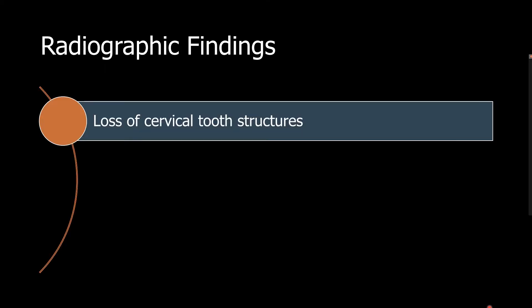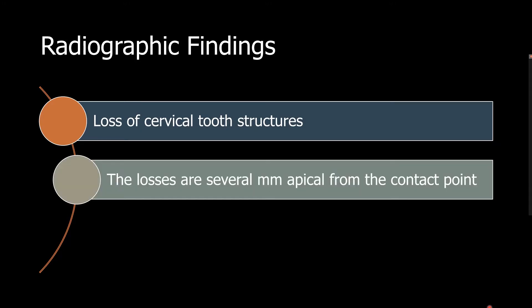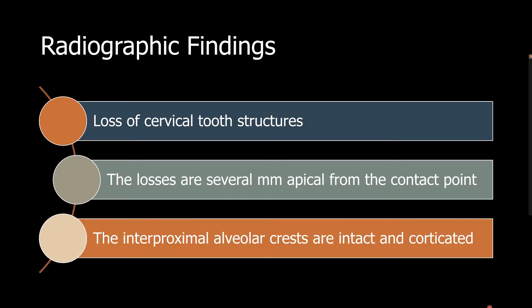In review, we have seen loss of cervical tooth structure both on the mesial and distal. We also saw that the losses are several millimeters from the contact points. We also saw that the interproximal alveolar crests are intact and corticated. With this information, we can develop a differential diagnosis.